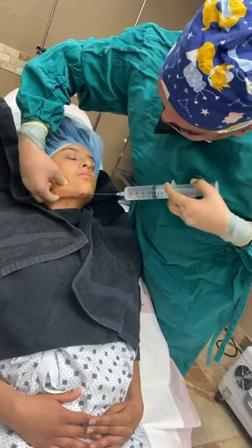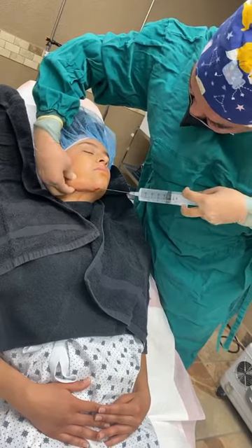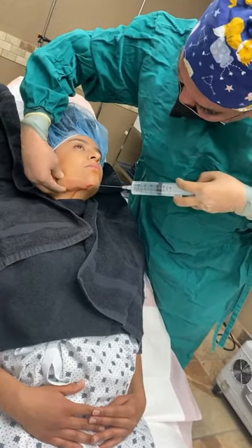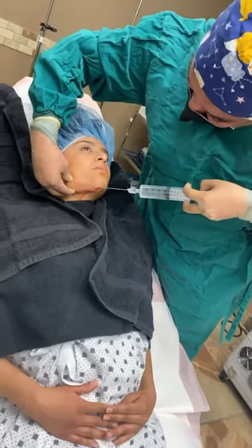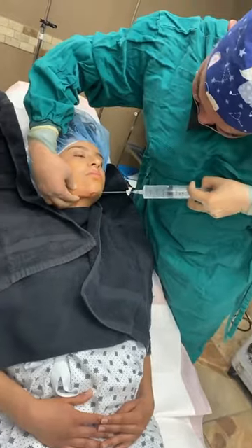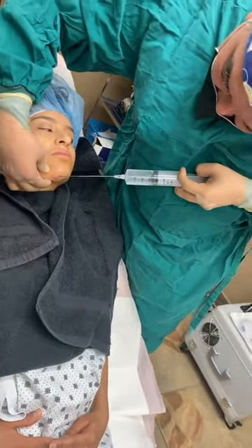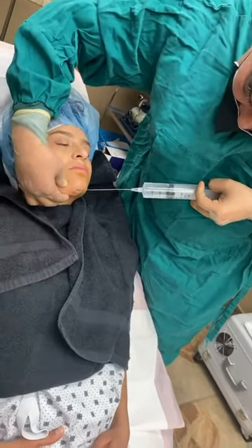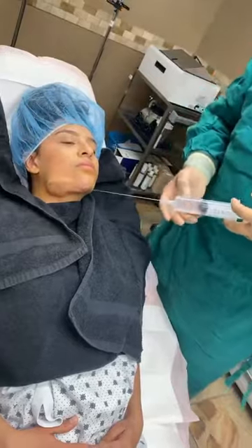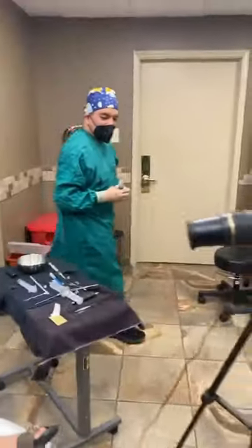Turn your chin, sir. Now again, this seems to be a lot. I don't need this much, but as I said, in thin patients, you want to make sure that you separate the skin from the underlying tissue and vessels. So the fact that we're using more than necessary is actually good. So let's turn around. We're going to do a little dance, and I'm going to do the other side.